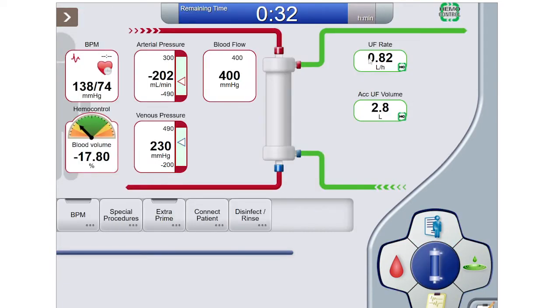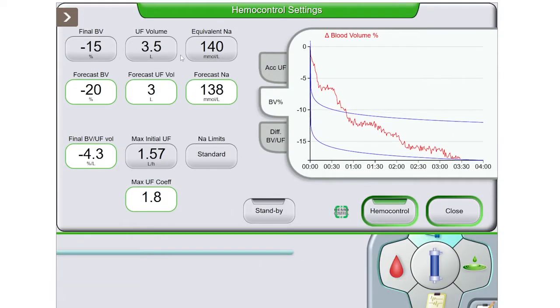because actually we only have 2.8 liters accumulated. So that's a 0.7 that we need to make up in the last 30 minutes of treatment, which is a fairly large volume, especially considering we've already removed a large portion of the fluid and we've cleared their blood for 3.5 hours, leading to likely a lower rate of fluid shifting off of the tissues into the vascular space. So I don't think this is a great representation.